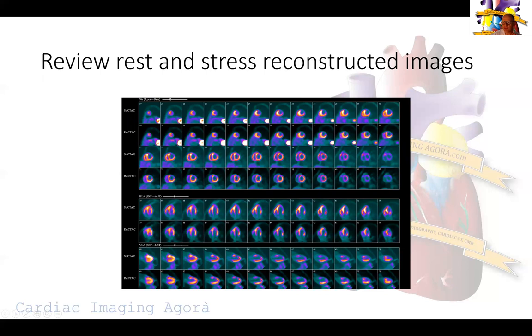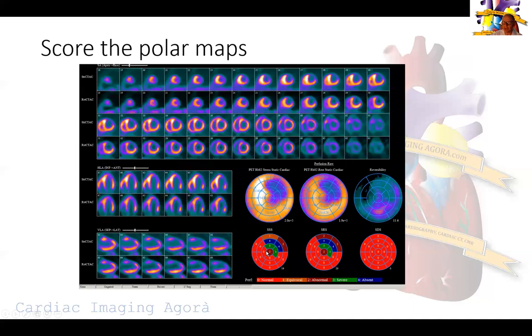Then we go to the reconstructed images — rest and stress clearly visible here in the short axis. There is a very severe fixed perfusion defect in the inferolateral wall. You can see it moving all the way from the apex to the base of the heart, sparing the very base where everything almost normalizes. In the vertical long axis images the fixed perfusion defect is again clearly visible, sparing the apex — we'll discuss that in a bit.